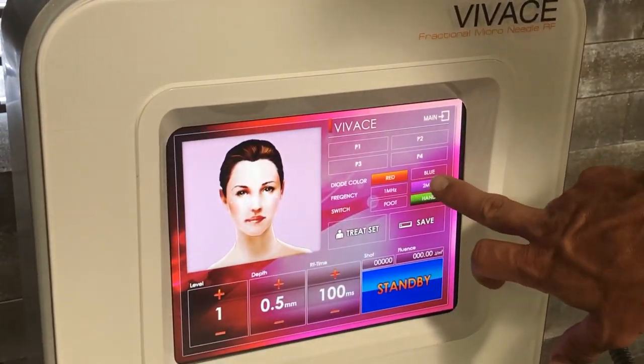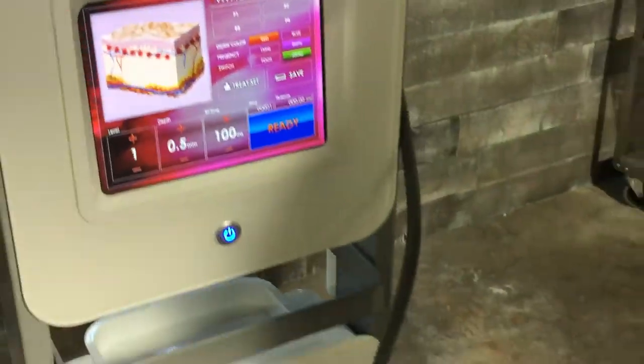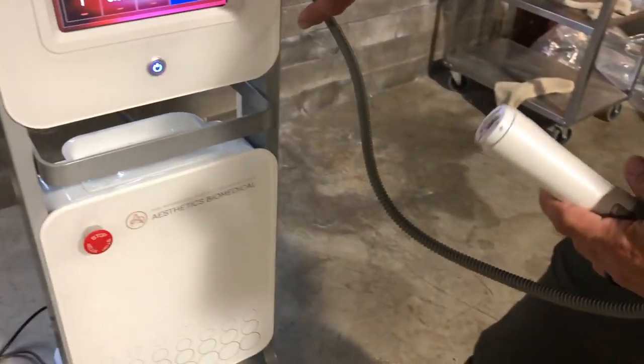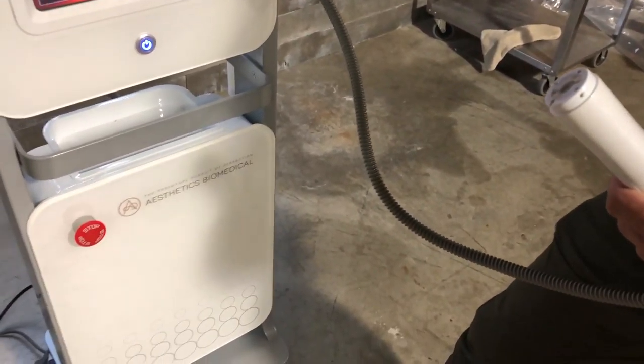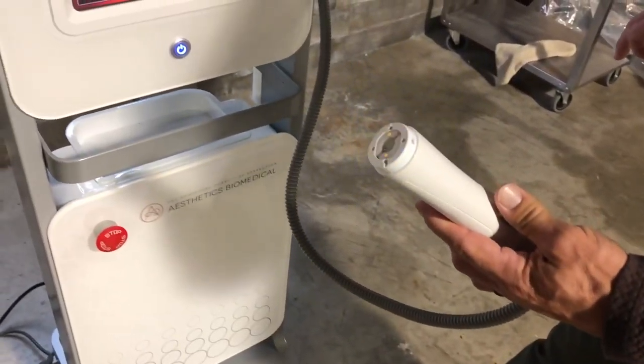This is equipped with the red and blue LED lights. It's on red right now, so I'll go ahead and fire it. You see the red light up. You can switch to the blue one and it's ready to go blue.